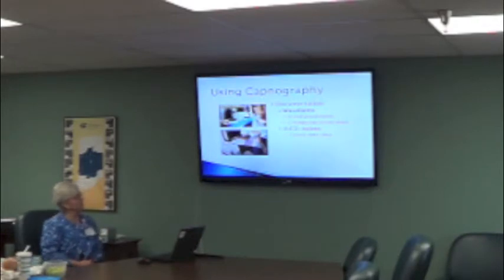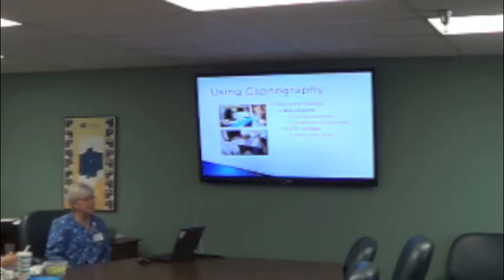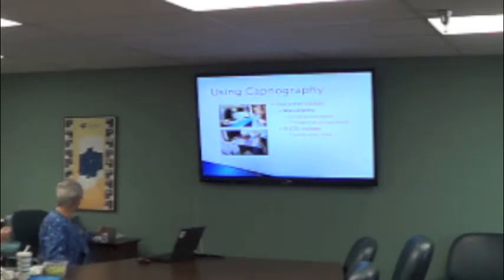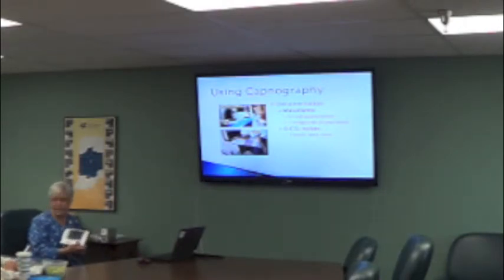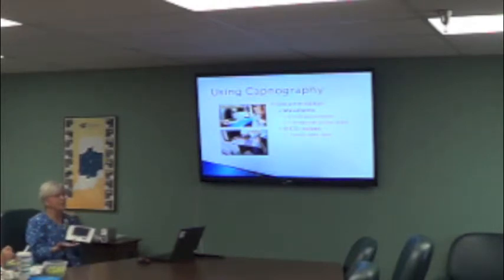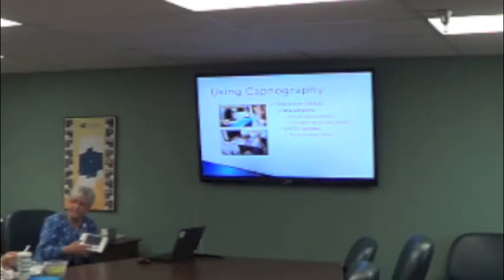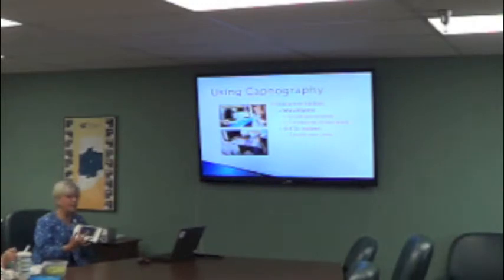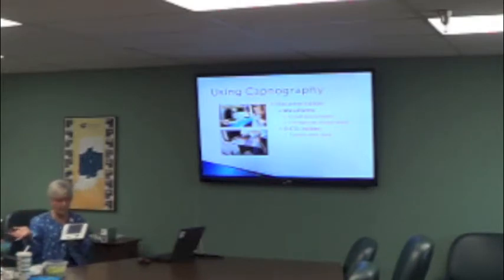So for capnography, you have waveforms and you also have a number that shows up. For the purposes that we use capnography here, our portable monitors, this doesn't print out, so we're only using this to get an idea of what our conscious sedation patients are doing. You look at the patient, it gives you a number to go with what you're seeing. I've given my patients on the PCA pump. They seem drowsy. They are having trouble coughing. Then this will give you a number to say, oh, my end-tidal CO2 was in the 30s and now it's in the 50s, so we've got a problem.